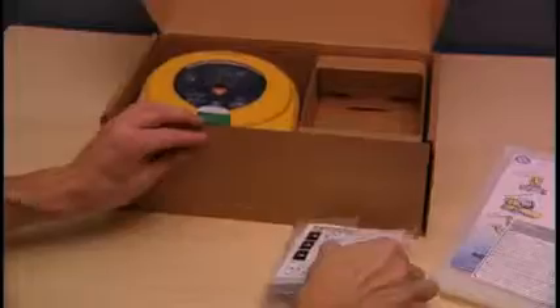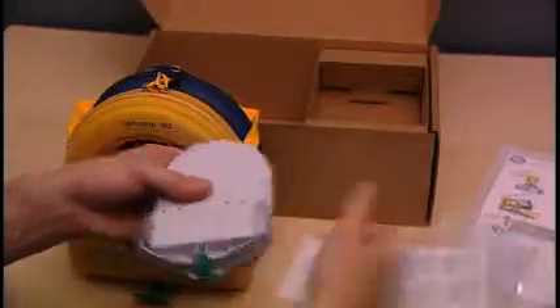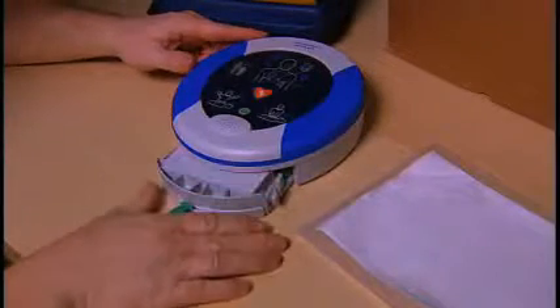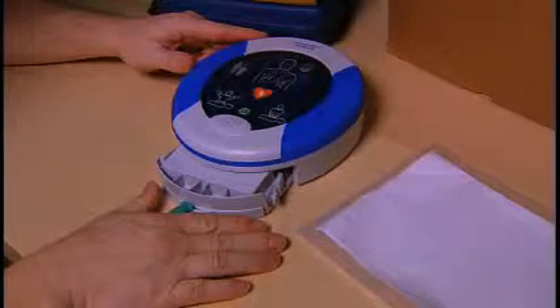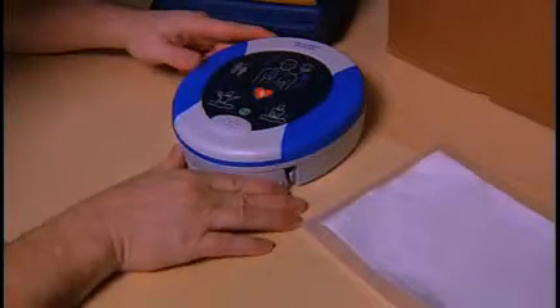To set up the Heart Sign Samaritan PAD, simply open the box and remove all the components. Remove the pad pack from the protective bag. The pad pack must be inserted in the Samaritan PAD for the device to be operational. To do this, slide the pad pack into the slot on the underside and push it firmly to ensure it's fully inserted. You will hear it click into place.